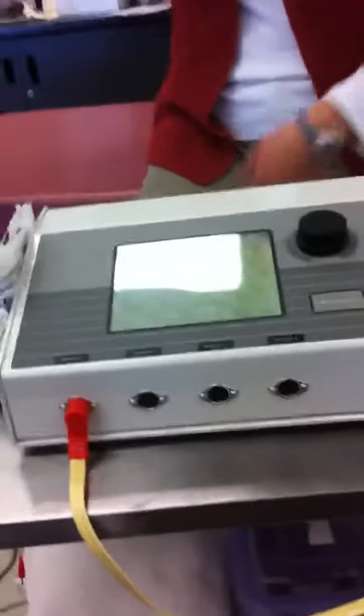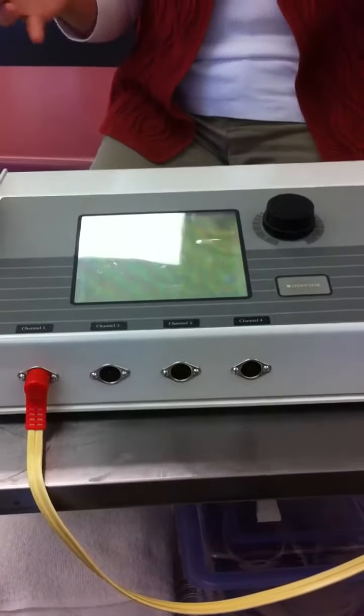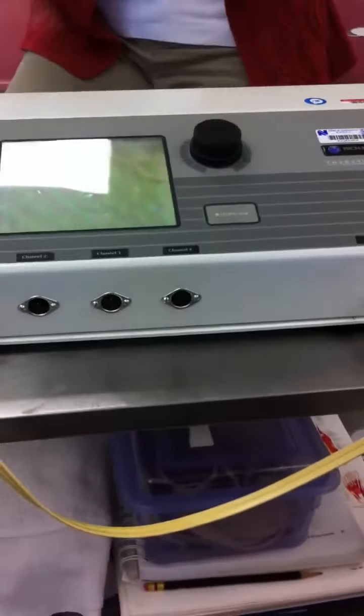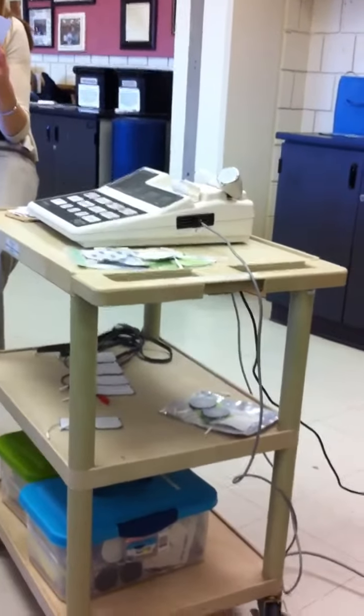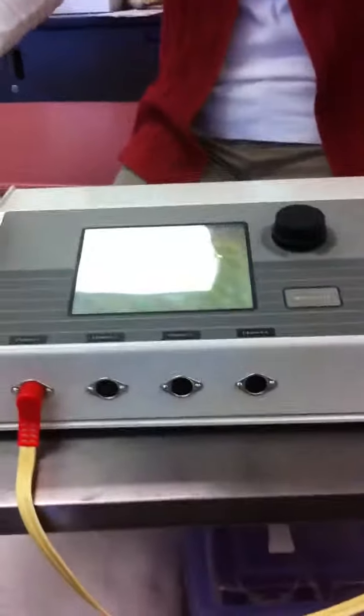Okay? So this is sometimes not the best machine to use with your patients, because if they accommodate or you don't get the outcome, the stimulus that you were looking to get, there's nothing you can do. Unlike with a machine like this, where you can increase frequency, decrease frequency, all of that. And you can change your on and your off time to progress your patients. This you can't. This is Russian protocol.